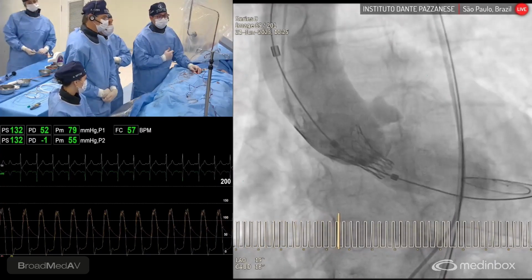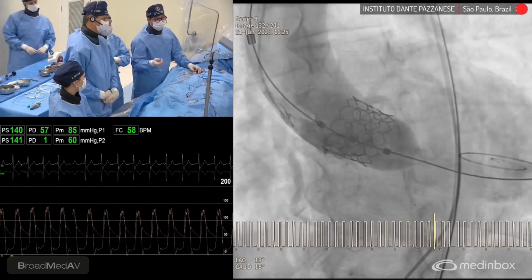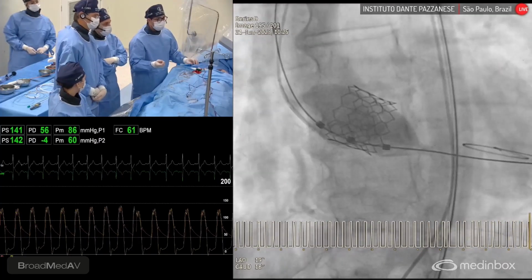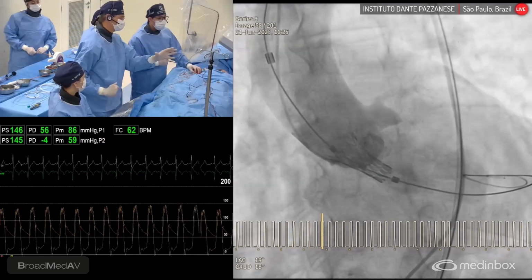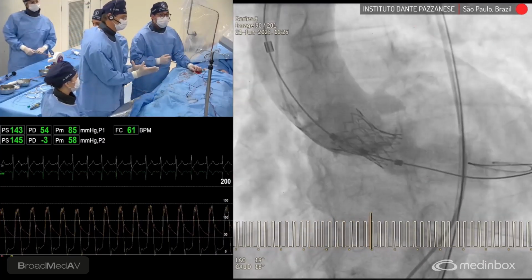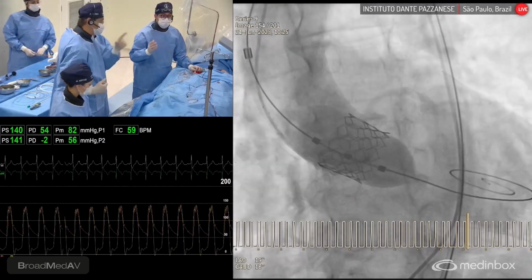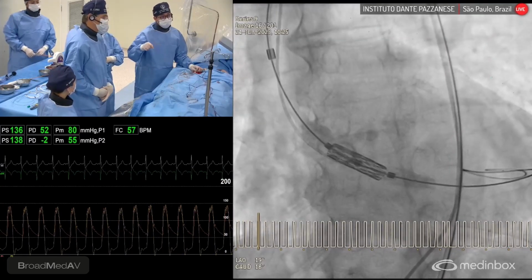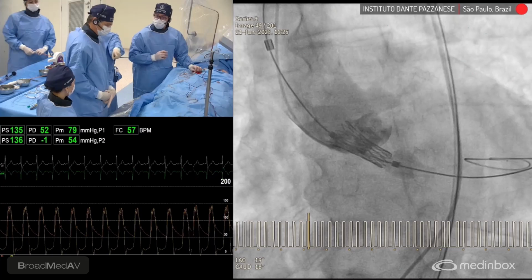So yes. And can you tell us, Alberto? Yeah, during the inflation, if you perform an angio, you have a chance to replace the valve by millimeters to place it in the best position we can reach. Were you worried about the high implantation that you could miss the valve or not in this situation? In the bicuspid scenario, we showed you that the calcifications are at the top of the cusp.